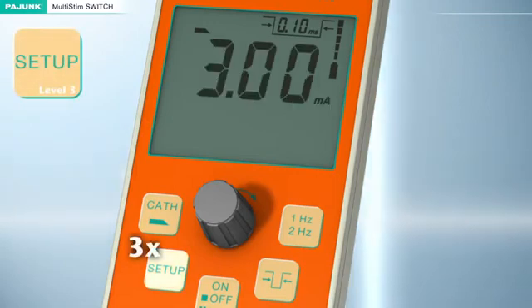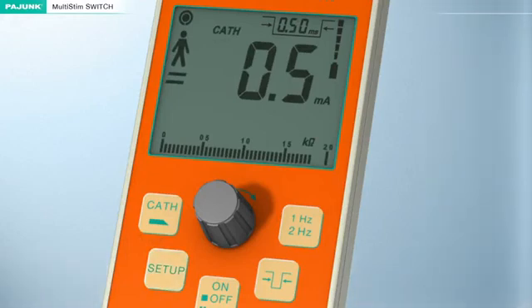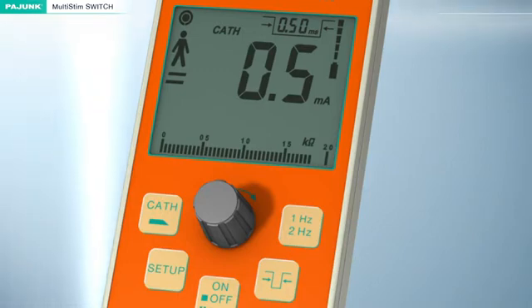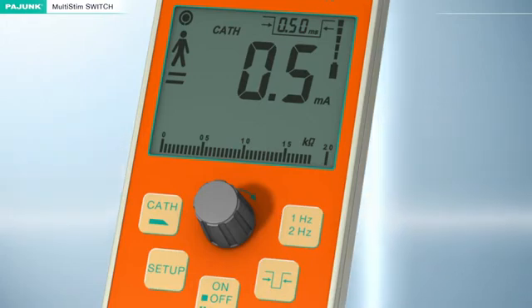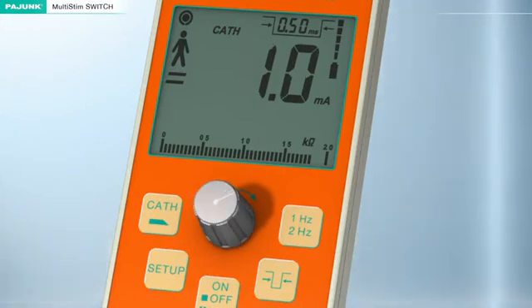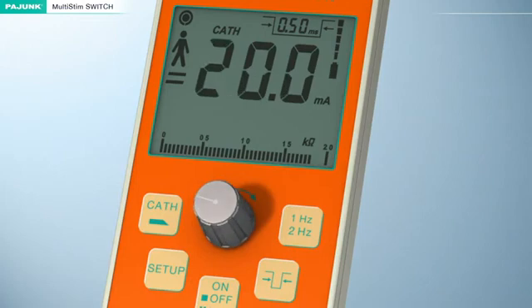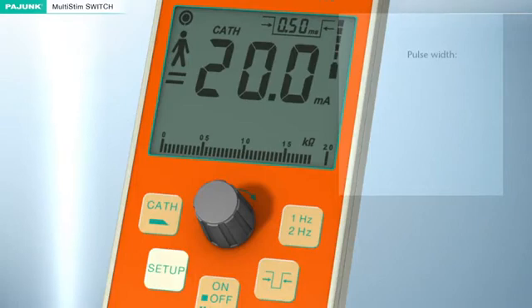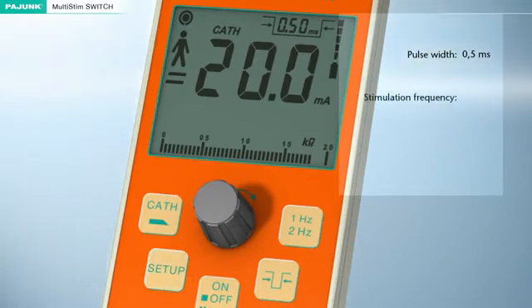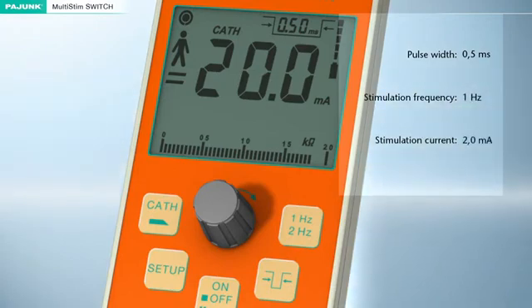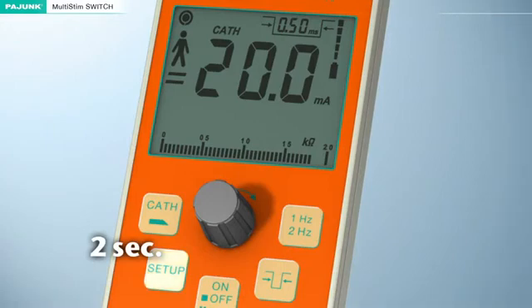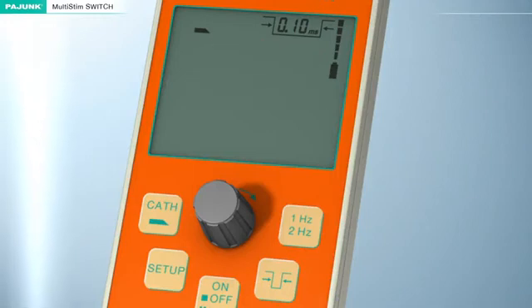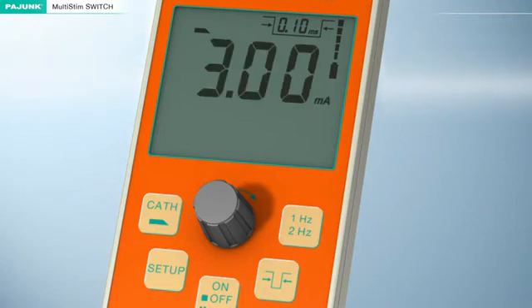Setup Level 3: The catheter mode can be adjusted in level 3. Individual stimulation parameters differing from the manufacturer's default settings can be defined. The settings for frequency and impulse bandwidth must be adjusted in normal operation before pressing the setup button for the first time; current intensity can still be varied in the setup function. The factory settings for catheter mode are: pulse width 0.5 milliseconds, stimulation frequency 1 Hz, stimulation current 2.0 milliamperes. Press the setup button for at least 2 seconds to permanently store the values; a monitoring sound confirms storage and the device returns to pause mode.